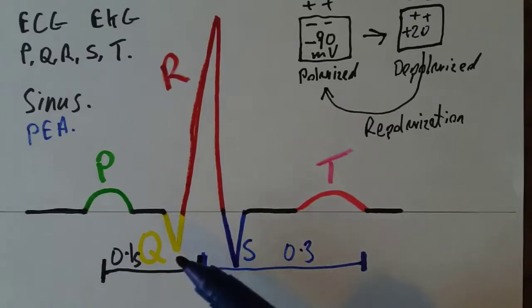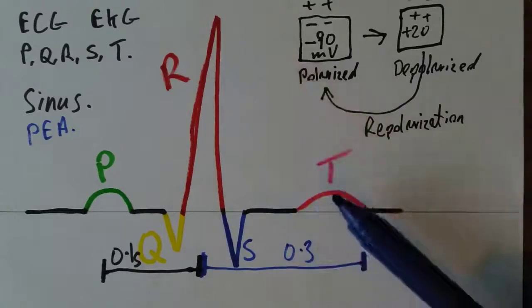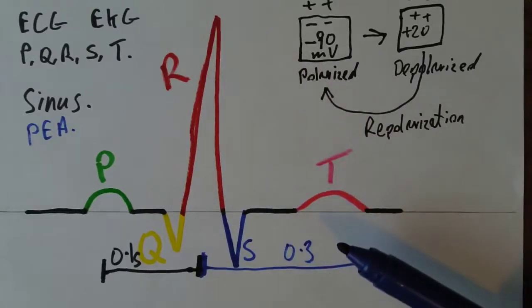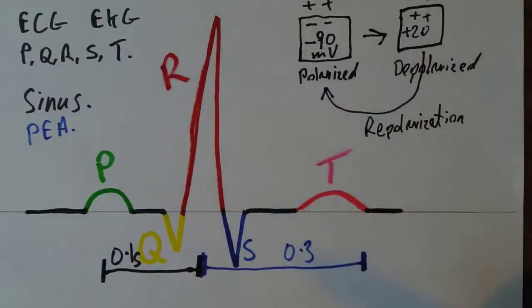Now with practice, these ECG readings can tell us all sorts of things. We can do positional ones called 12-lead ECGs. They'll tell us about the normal conducting pathways. They'll tell us about heart damage. They'll tell us if the heart is enlarged. And they can also tell us what's causing myocardial pain. So well worth learning the basic PQRST. And then with experience, you'll realise that this has lots of implications for pathology, patient assessment, and patient management.